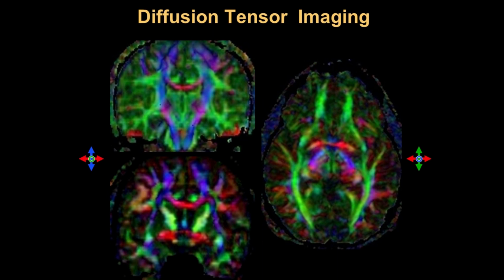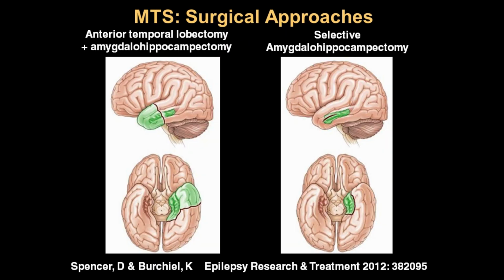So, for example, the white matter stem, we might be able to see some decrease in fractional anisotropy in an epilepsy case. But how much this is clinically useful, I'm not sure, to be honest with you. We're not using it clinically in our practice at this point. We are using DTI for a range of other mapping applications and for preoperative assessments, however.